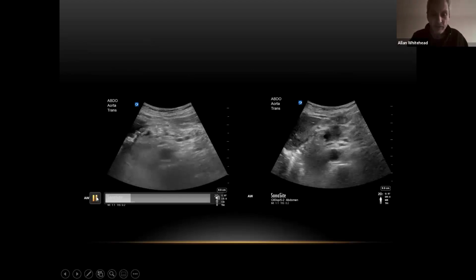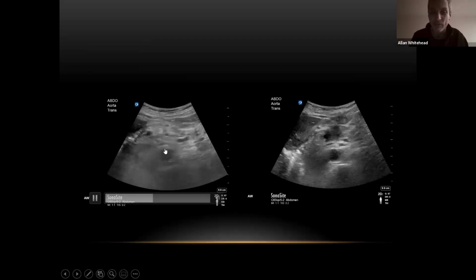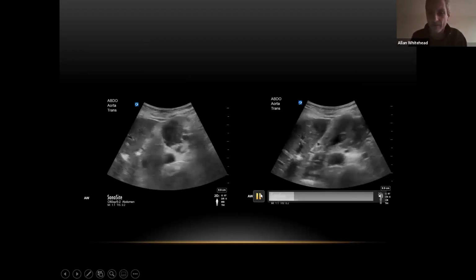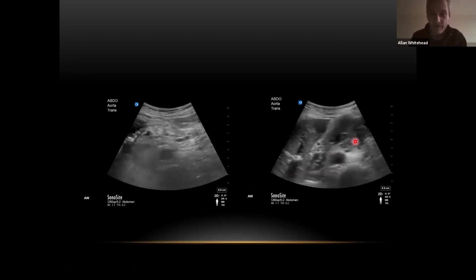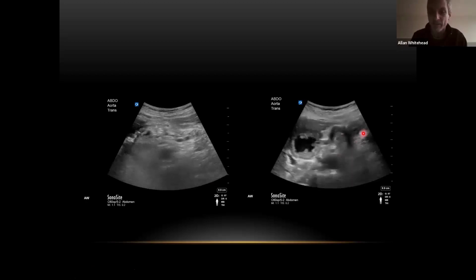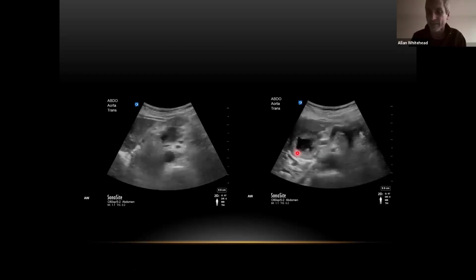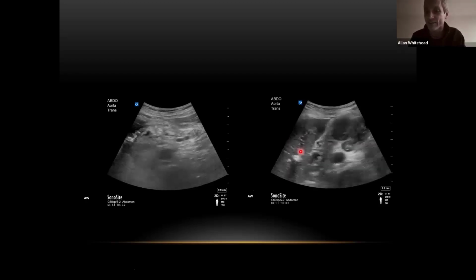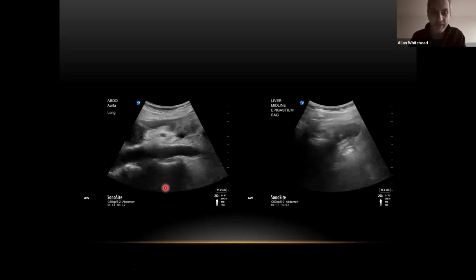Sorry, I haven't got it set up on automatic. So there's the aorta, and I'm going, okay, I'm starting to see something that doesn't look like it's in the right spot there, and it's on top of the aorta. I wanted to just make sure I was happy with the aorta to start with. And I was pretty happy with the aorta. I wasn't quite so happy with this thing sitting up here. And then I wasn't happy with that either, which is sort of a giveaway that something's going on, because there are cavitating anechoic, irregular looking lesions sitting in the liver. So I'm thinking, okay, let's have a little bit more of a look. So we went into a long axis on the aorta. I was again happy with the aorta.